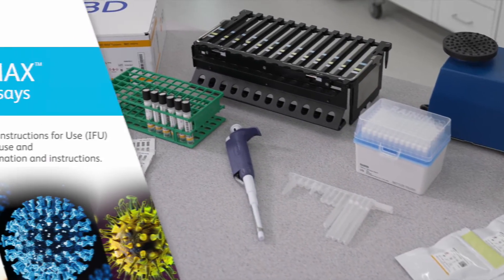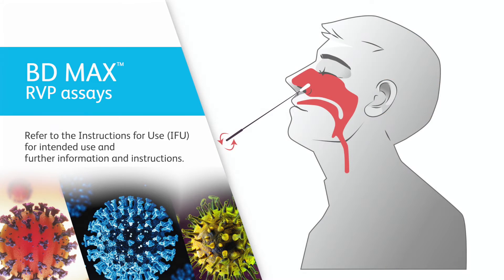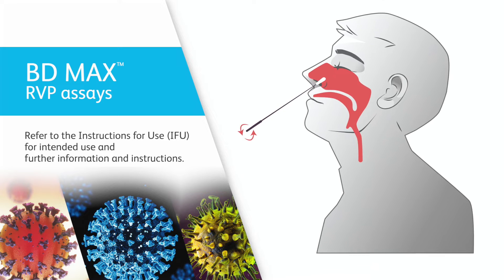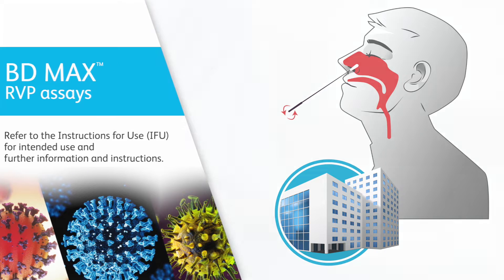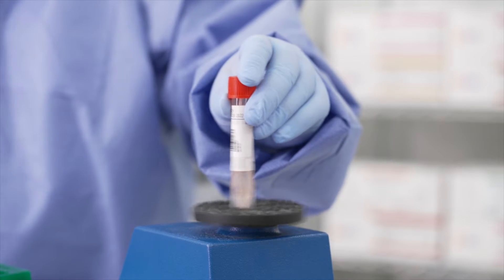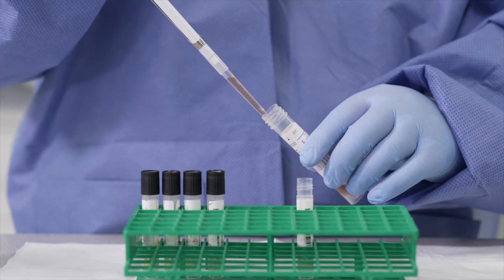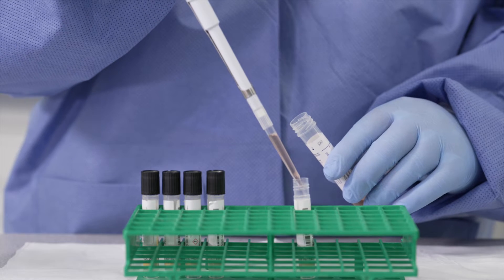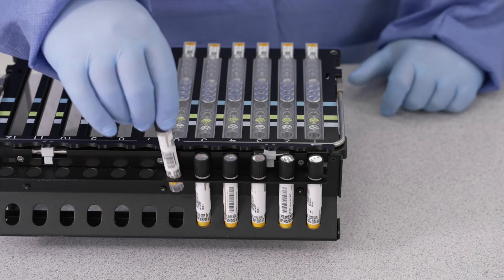The BDMAX Respiratory Viral Panel, RVP, performed on the BDMAX system, requires a nasopharyngeal or anterior nasal specimen to be collected and transported to the laboratory using the swab recommended in the instructions for use. After a brief vortex of the sample buffer transfer tube to release cells from the swab into the buffer, the specimen is transferred directly into the corresponding BD molecular RVP system sample buffer tube, which is then placed into a BDMAX system rack.